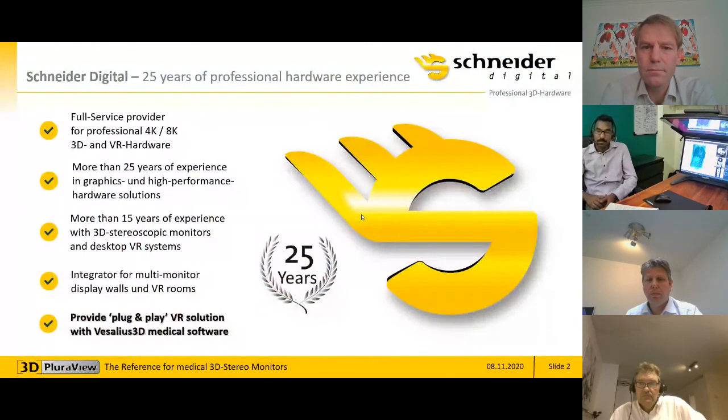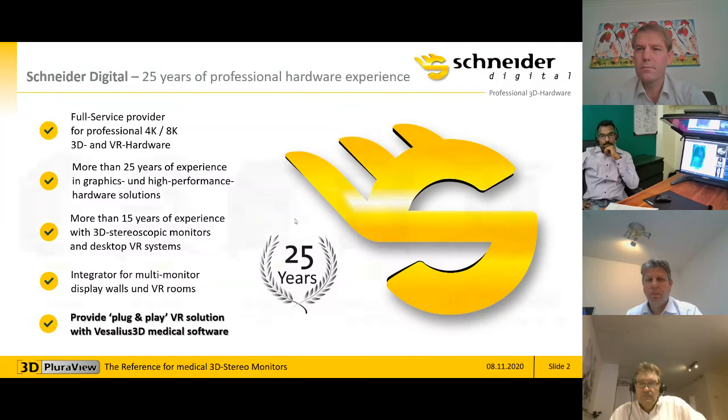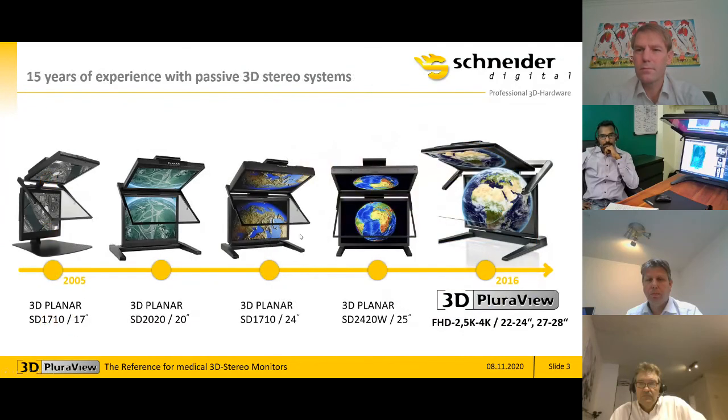Introducing Schneider Digital, introducing Visualius. We have a lot of experience with the hardware. This is the lineup of the previously available dual screen passive stereo monitors, starting with Planar back in 2005. And we took over this dual screen passive stereo business from Planar in 2015. In 2016 we came out with the further developed PluraView series.